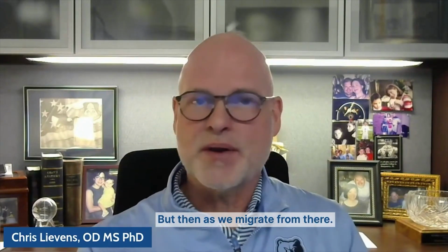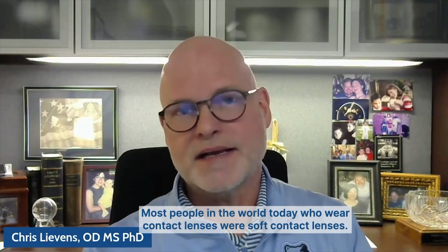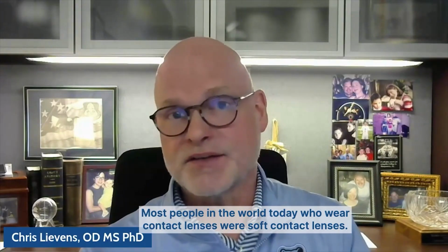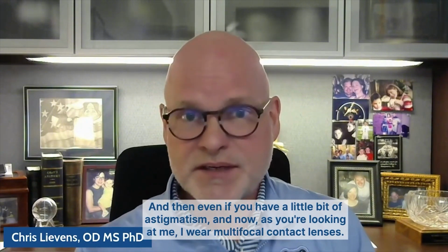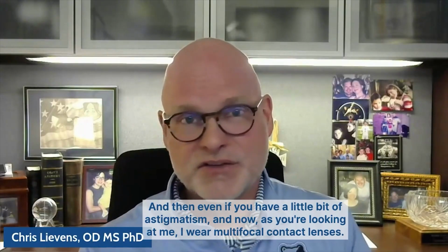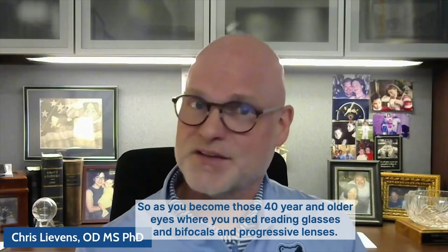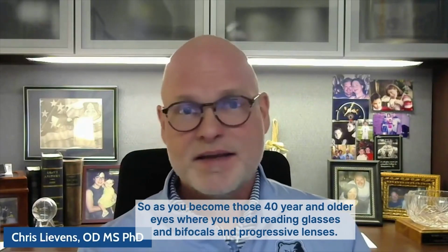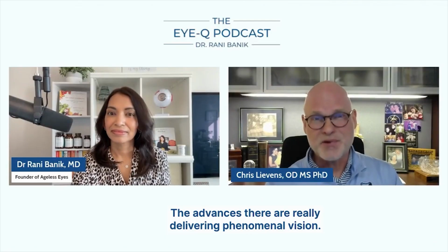But then as we migrate from there, most people in the world today who wear contact lenses wear soft contact lenses, those that correct a common refractive error. And then even if you have a little bit of astigmatism, and now as you're looking at me, I wear multifocal contact lenses. So as you become those 40-year and older eyes where you need reading glasses and bifocals and progressive lenses, wow, the advances there are really delivering phenomenal vision.